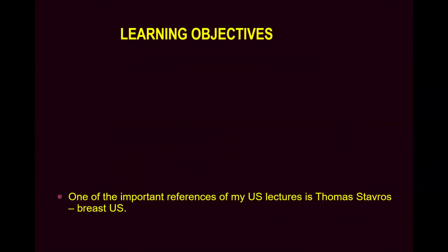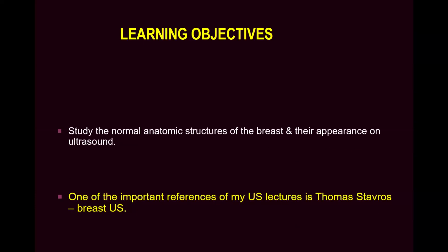Let us mention again our goals or educational objectives of this series of sonographic anatomy lectures.